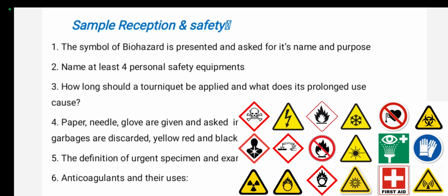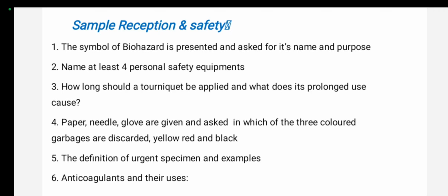So hemoconcentration is very common. We may be asked this kind of questions. For your direction, we may be asked this kind of questions. Another thing is we may be given paper, a needle, and a glove, and we may be asked to dispose them in the biohazard garbage, the yellow, black, and red garbage.